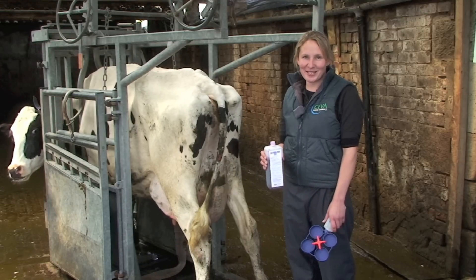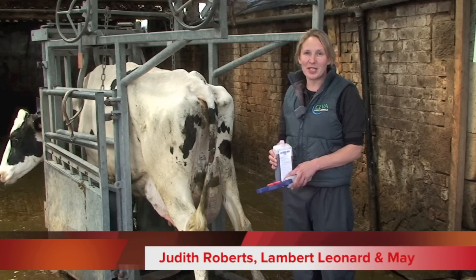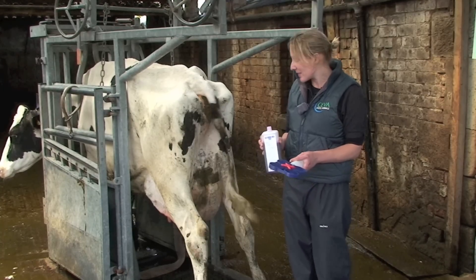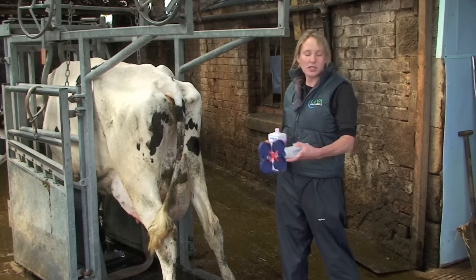We're going to perform a California mastitis test on this cow to test her for subclinical mastitis. It looks for any quarters that are around 400,000 or more in terms of cell count, so it's useful in herds that don't milk record.